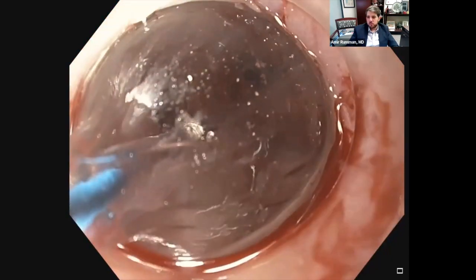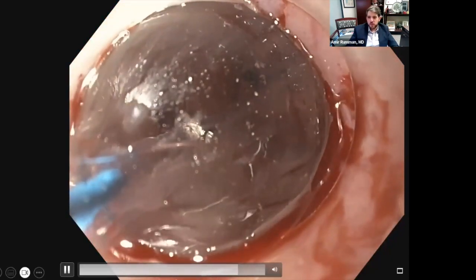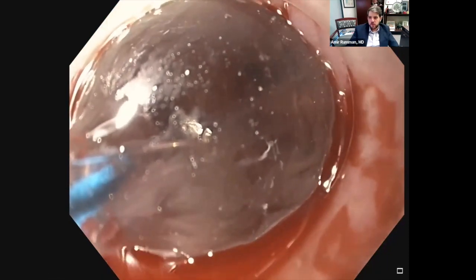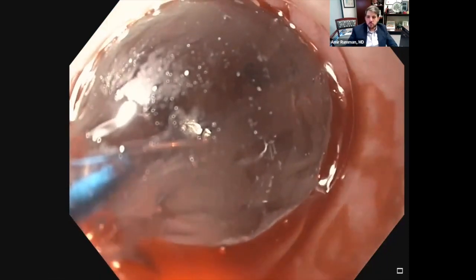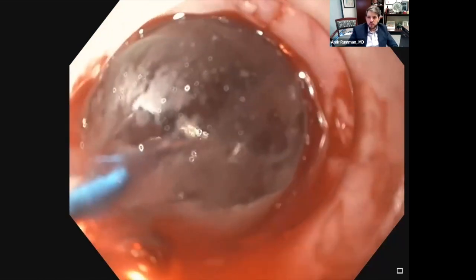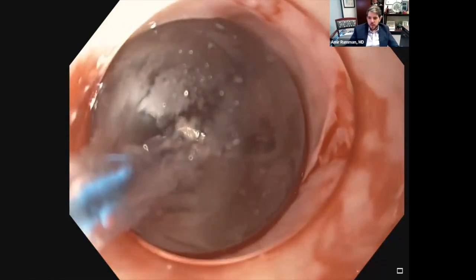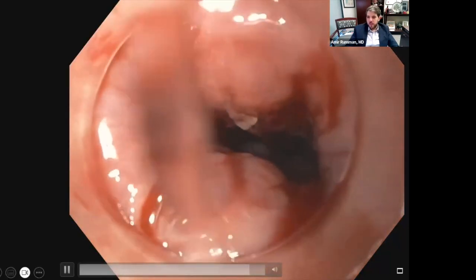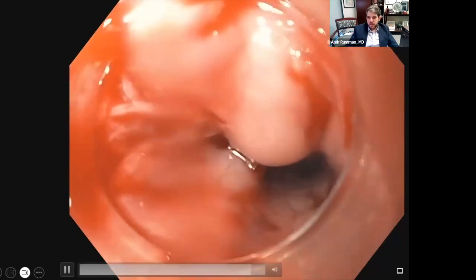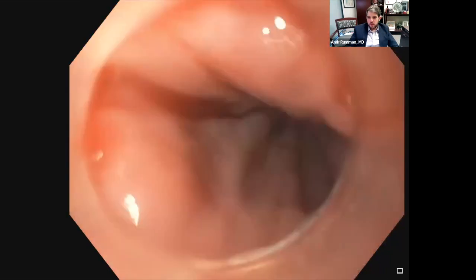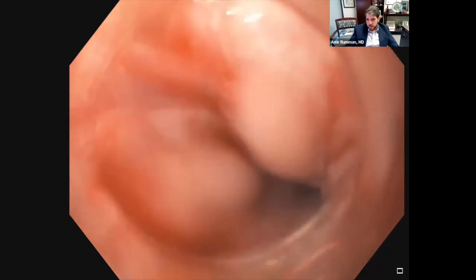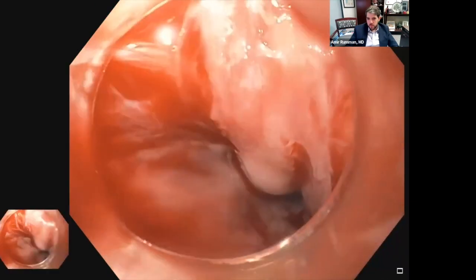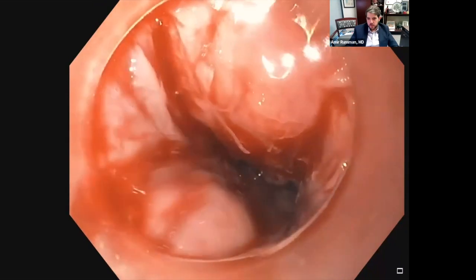We're going to hold the balloon for a while and continue to look through to make sure that our tear isn't propagating very rapidly or very deeply. Once our 60 or 90 second period is over, we're going to deflate our balloon and examine the stricture for any signs of perforation or deep muscle injury. Generally we want to see something — you don't want to dilate and not create any mucosal rent. We're seeing some submucosal fibers, nothing that looks like a deep muscle injury here.